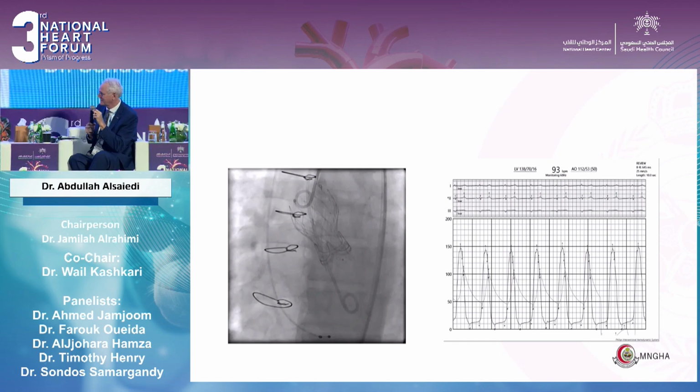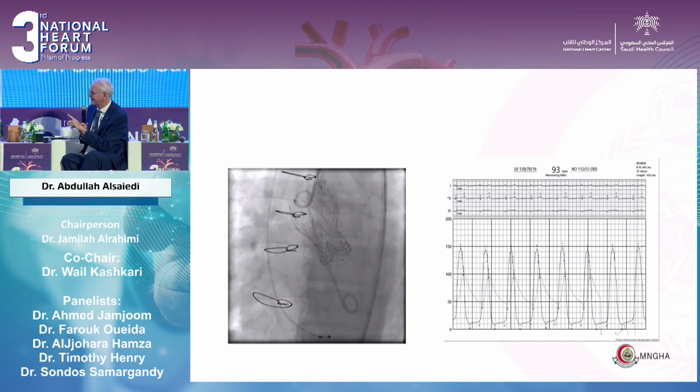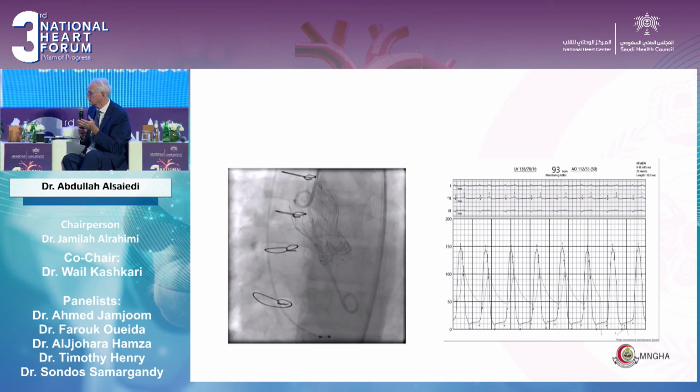This is becoming an increasingly common problem as people get older. So I think the essential thing is what you do the first time. And that's a really important point, to make sure that you put in the largest size you can safely put in the first time. And that's true whether you're doing it surgically or with TAVR. This is going to become a really increasingly common problem as we have more valves and people are getting older and older.